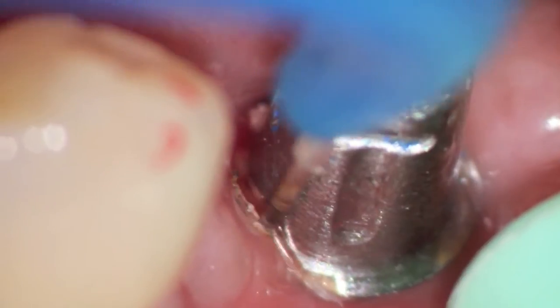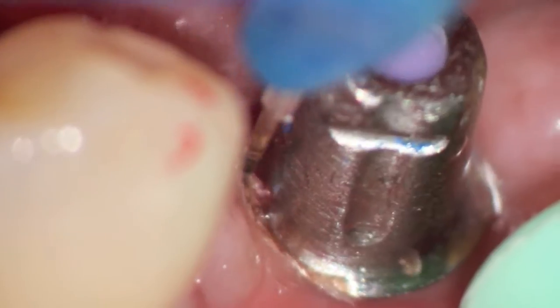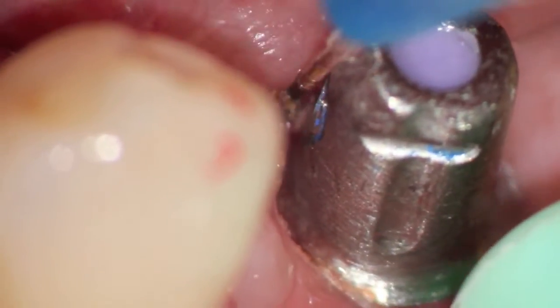That's 30 microseconds on, 30 microseconds off. We're using short brush strokes here with a 90-degree tip, 10 millimeters in length, that is being used to remove soft tissue around the implant itself.